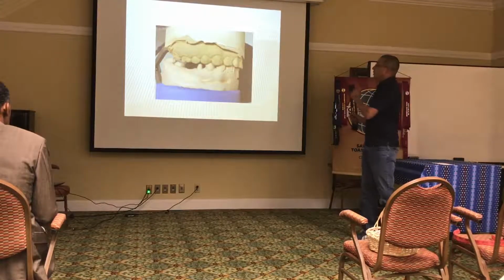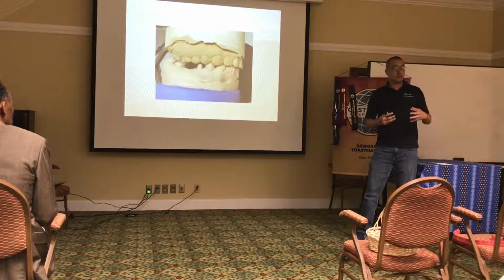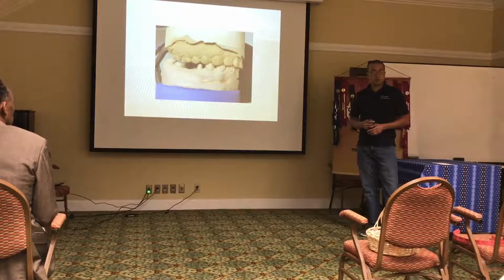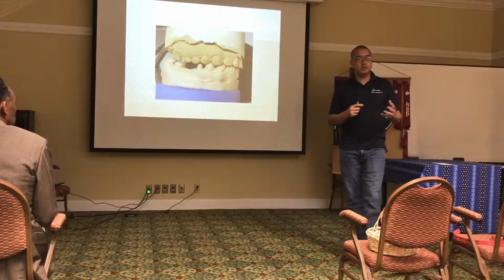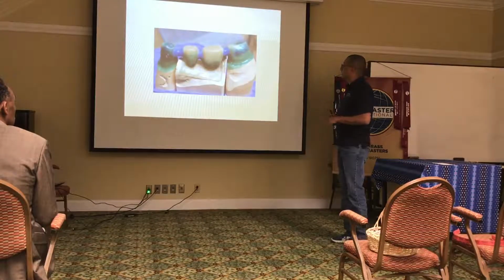After that, we go ahead and do the model, upper and lower. Now from here, we still inspect, and then that's when we can call the dentist and say, okay, you need to improve this part, or, it's good to go, or any communication that we need to let the dentist know what it is about that for us to do the restoration.